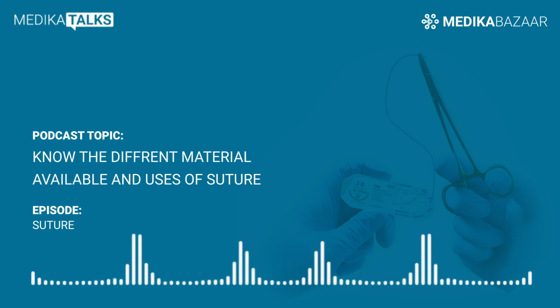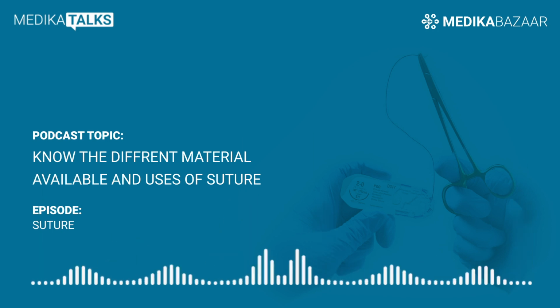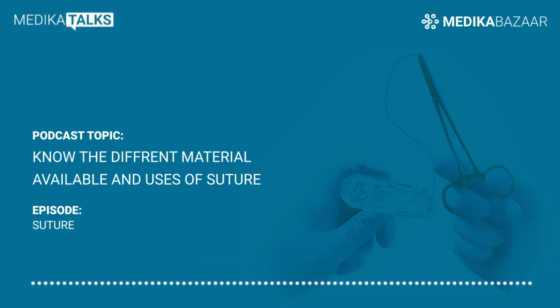A suture is also classified based on the actual structure of the suture material. For instance, a monofilament suture comprises a single thread that allows the suture to pass through the tissue easily. In contrast, a braided suture consists of many small threads which are braided together.